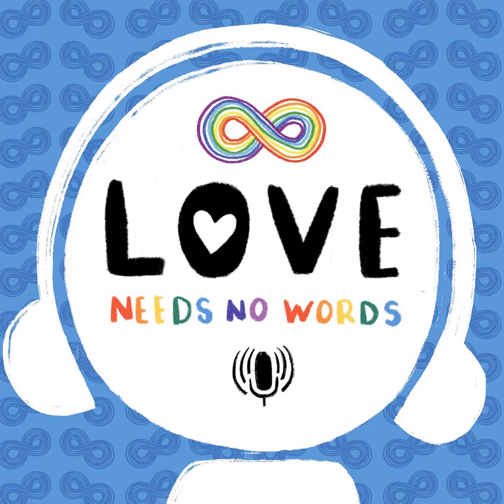As well as that, your child might have some specific things that are important to them around communication that we want to consider. Many of your listeners will have heard of Gestalt language processing, and will be thinking, we want to make sure we can record some of my child's original audio that they love, or original phrases that they love. So we need to make sure the app does that if we know that's important. So we do need to consider all those things, and there is a process there.